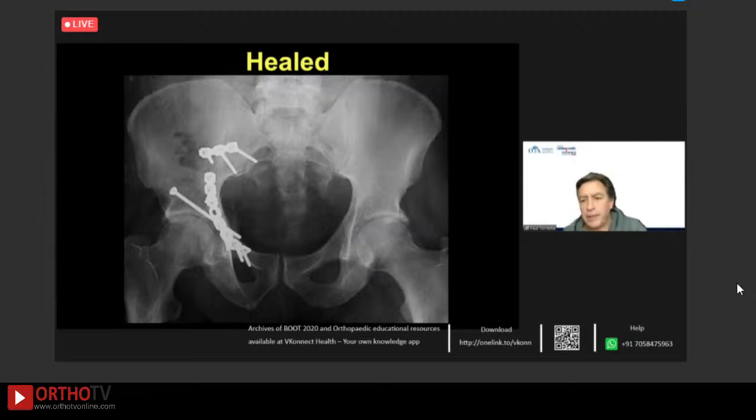Any closing comments, Hassan or Dr. Tricca, anything that... how do you deal with that from the AIP? How do you deal with that compressive? Do you put a different clamp on the inside to compress similar to what I did, Hassan, or do you just add it?